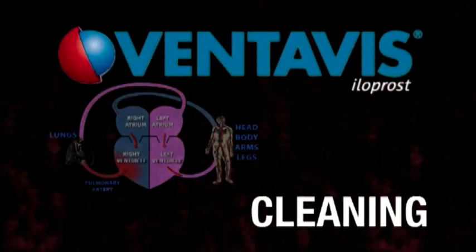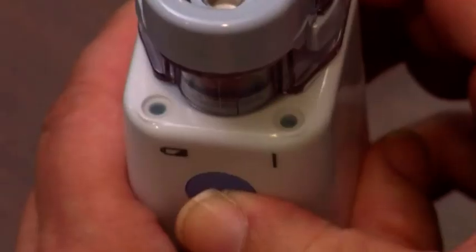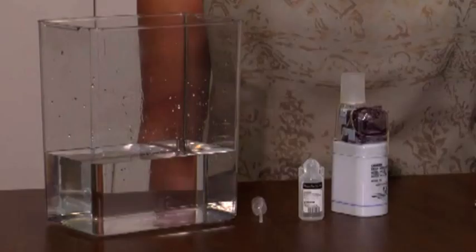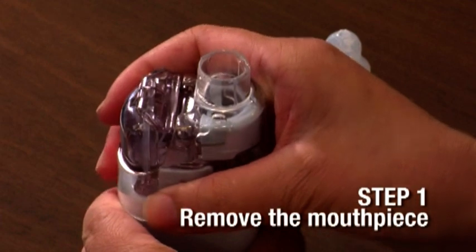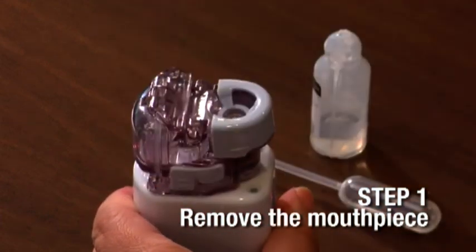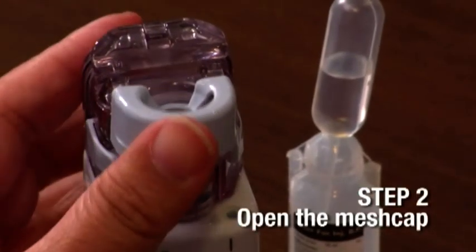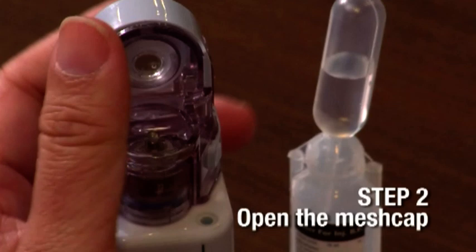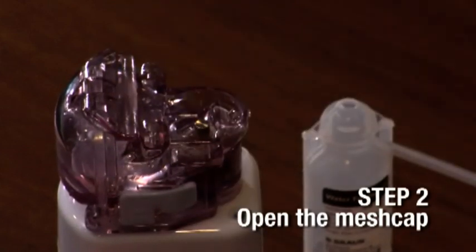Always clean the nebulizer immediately after each session. This ensures that all leftover medicine on the nebulizer is removed and avoids the use of non-sterile medication in future sessions. Also, this way the equipment is ready for your next session. Remove the mouthpiece. Lift the mesh cap up by applying a firm push with your thumb on its rim, then lift it perpendicular to the medicine chamber and remove it.